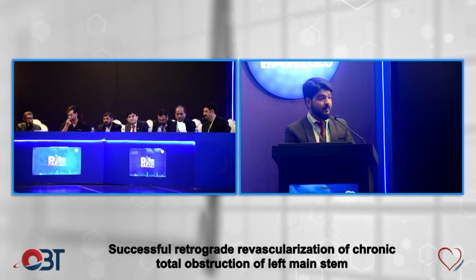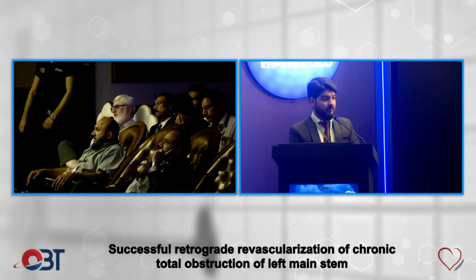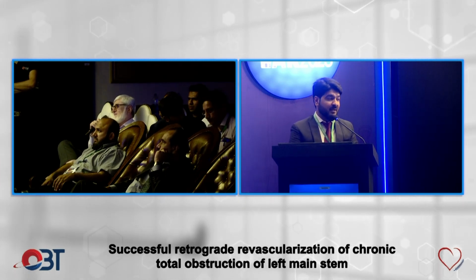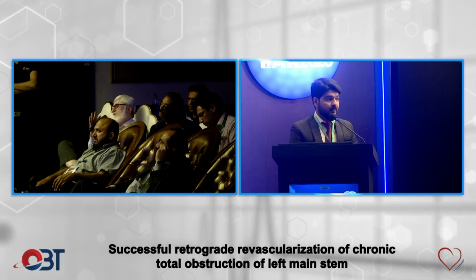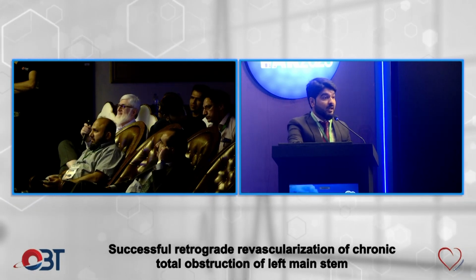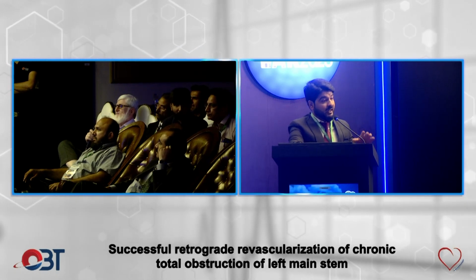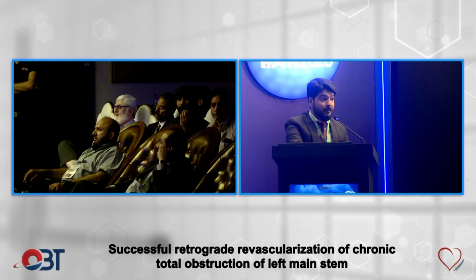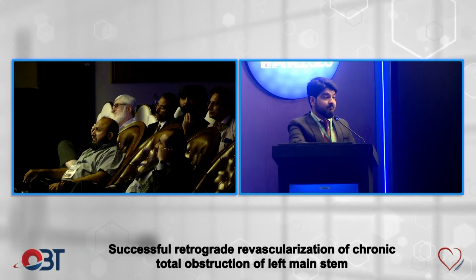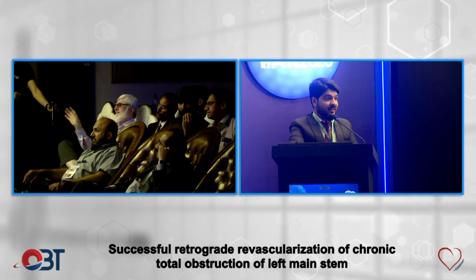Will this again cause the vessels to become atretic on either side, because there is a good flow from the graft and the LAD? In such a situation, if there is a competitive flow, both of the vessels suffer. So what will be your strategy? Sir, the SVG graft is working functionally. We did angiogram after stent deployment. The SVG is already working, but that is the reason there will be competitive flow and things will get worse with time. Sir, we have followed the patient, and the patient has symptomatically improved a lot.